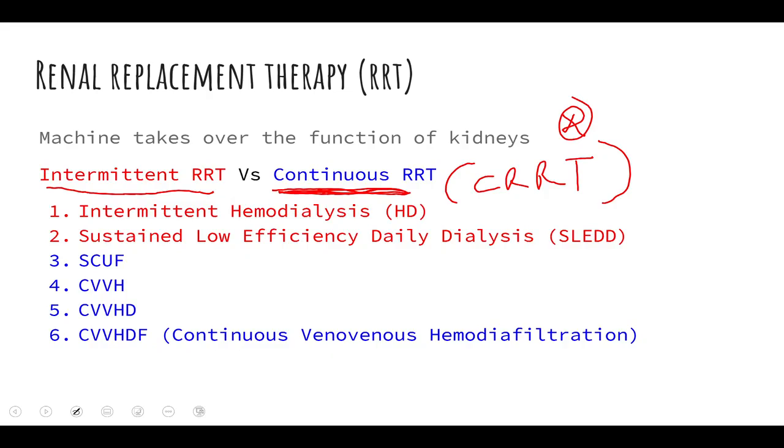That is a pretty aggressive way of treating a fluid imbalance or electrolyte imbalance. But for most of us, for me and for you watching this video, that is possible. Most hemodialysis patients are able to tolerate that kind of therapy.